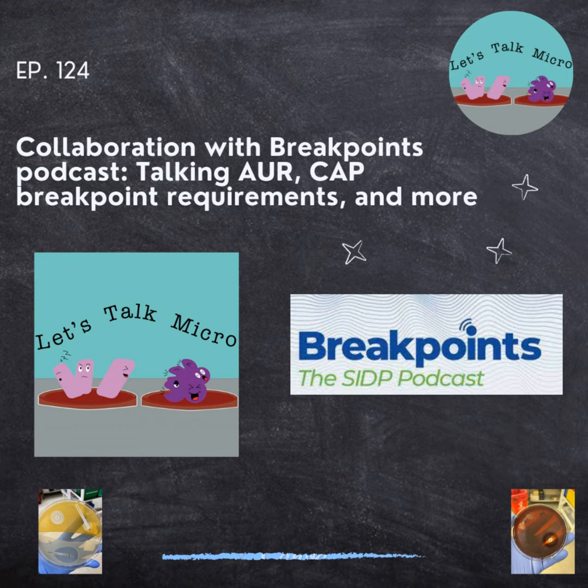And keeping that in mind will help, I think, quell a lot of panic that is happening in the lab, because we have those new piptazo breakpoints that came out. We have the new aminoglycoside breakpoints that came out from CLSI, but those will not be expected to be updated if you go through a review by CAP this year, correct? Yes, I think laboratories will be able to know what is the CAP checklist edition that will apply to them. So that is significant for them to be aware. If the current checklist was a revision from October 2024, I think it was 2022.